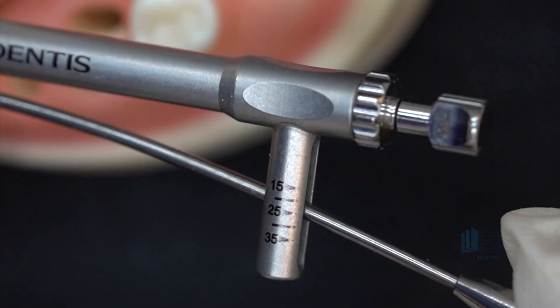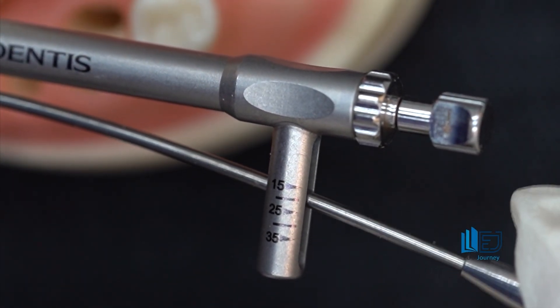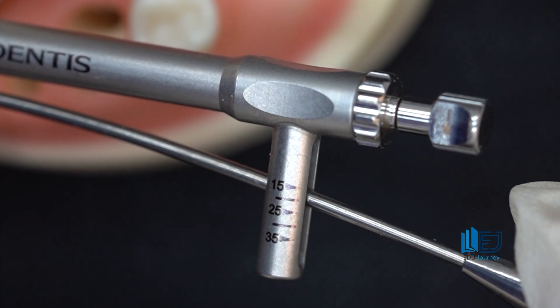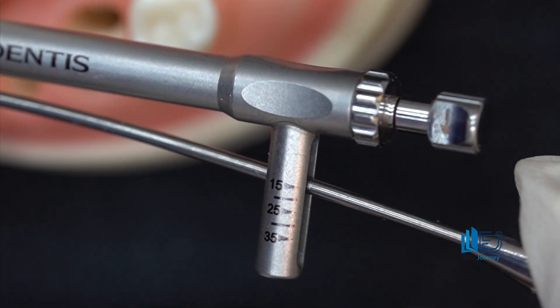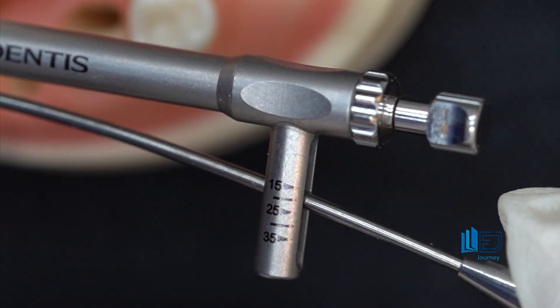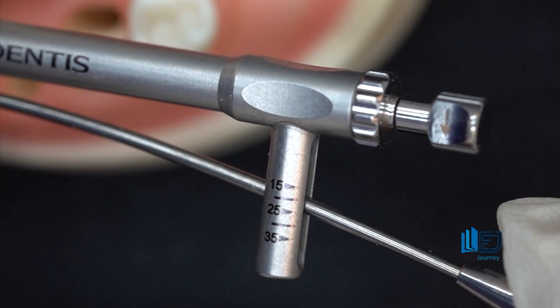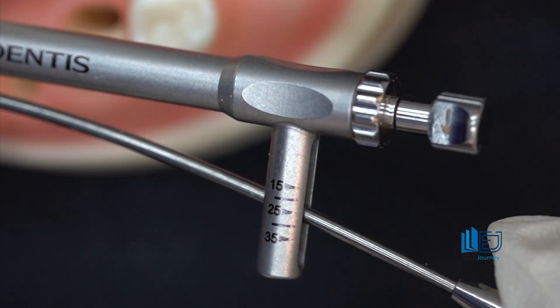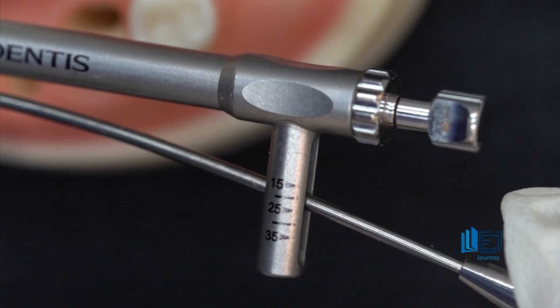Primary stability, which is essential for successful osseointegration, and the exact insertion torque applied during implant placement — if this number is above 25 or 30, it means primary stability is good, insertion torque is high, and you are allowed to use a healing abutment and perform one-stage surgery.